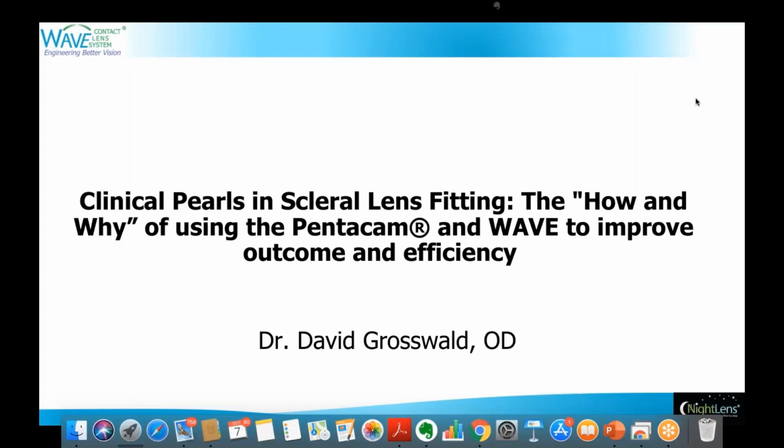I'm on the clinical application team here at Oculus, and I'd like to welcome you to tonight's webcast, Clinical Pearls and Scleral Lens Fitting, the how and why of using the Pentacam and WAVE to improve outcomes and efficiency.